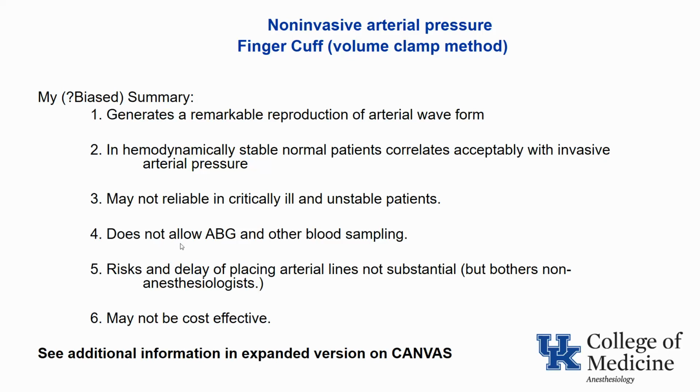It does not allow measurement of blood gases or other blood samples. In my opinion, the risk and delay of placing arterial lines is not substantial, although it bothers non-anesthesiologists, and it may not be cost-effective. A further discussion of this technology appears in the expanded version on Canvas.